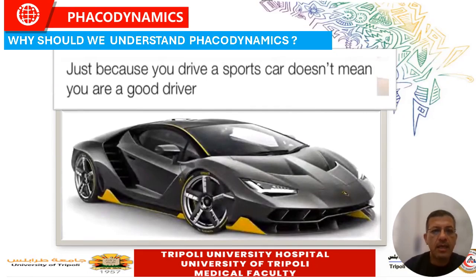Now, understanding the principles of phacodynamics or the fundamental principles of the phacoemulsification machine is a very important task for all anterior segment surgeons, because we are facing different types of cataract, from mild degree to moderate degree to a very hard cataract, and also we are facing different types of eyes: small eye, big eye, average sized eyes, and so on. So it is not one size fits all, where you just put fixed parameters for your phaco machine and use it for all patients.